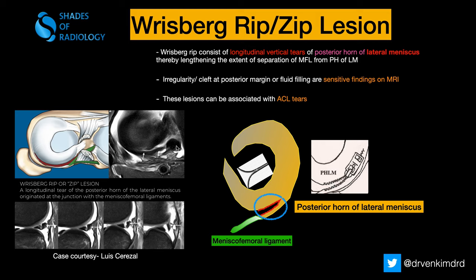In the axial image, you can see the tear here — this is the meniscofemoral ligament — and you can see the involvement of the posterior horn of the lateral meniscus. In the sagittal images as well, you can see the same tear, showing separation from the posterior horn of the lateral meniscus. This is the classic appearance.